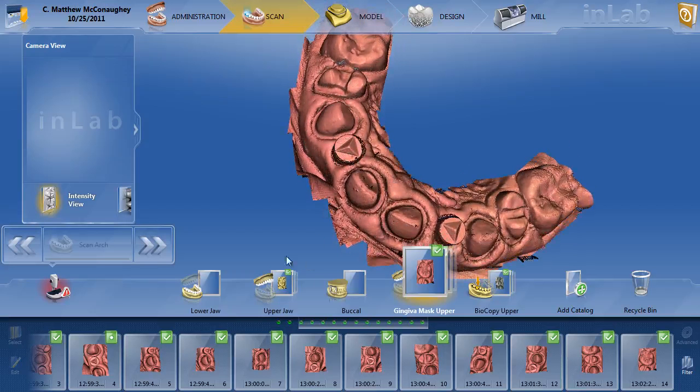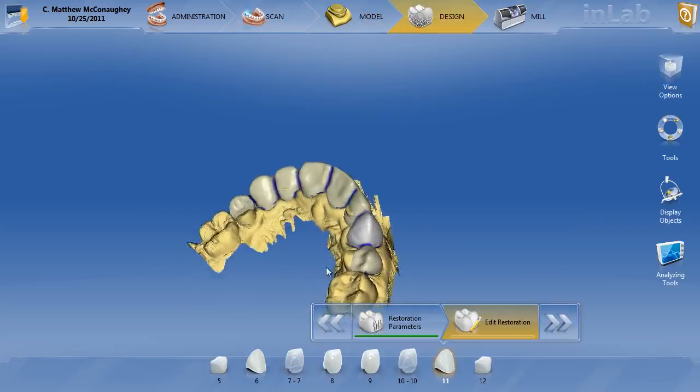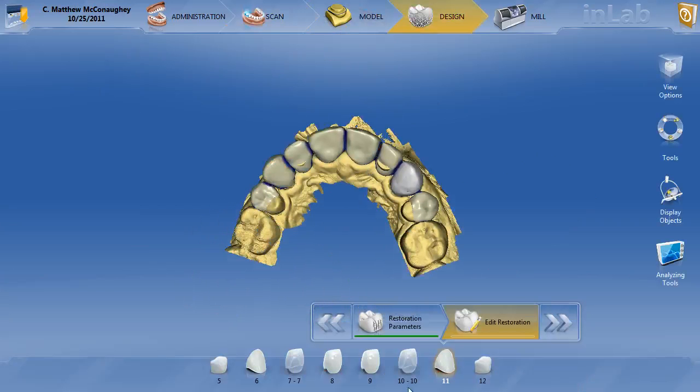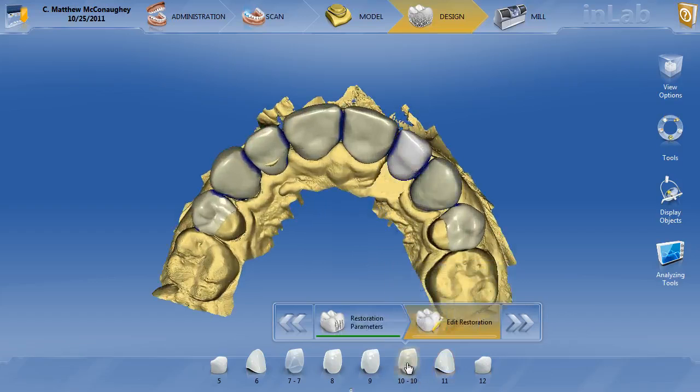Nonetheless, executed very nicely here — upper jaw, gingiva mask, biocopy. So let's go back to the design and click on tooth number 10. When you see 10-10, that means the file has already been split into an abutment and a crown. Let's go ahead and click on tooth number 10 and activate it.